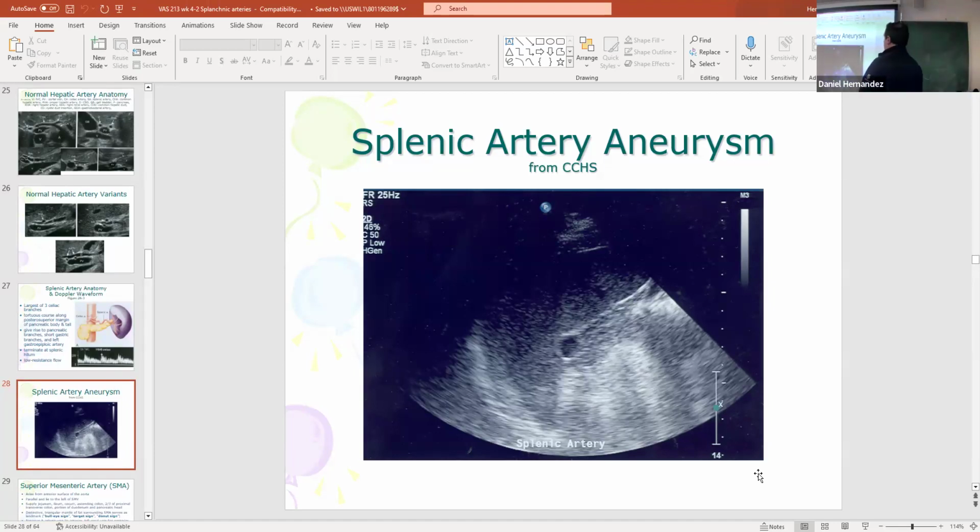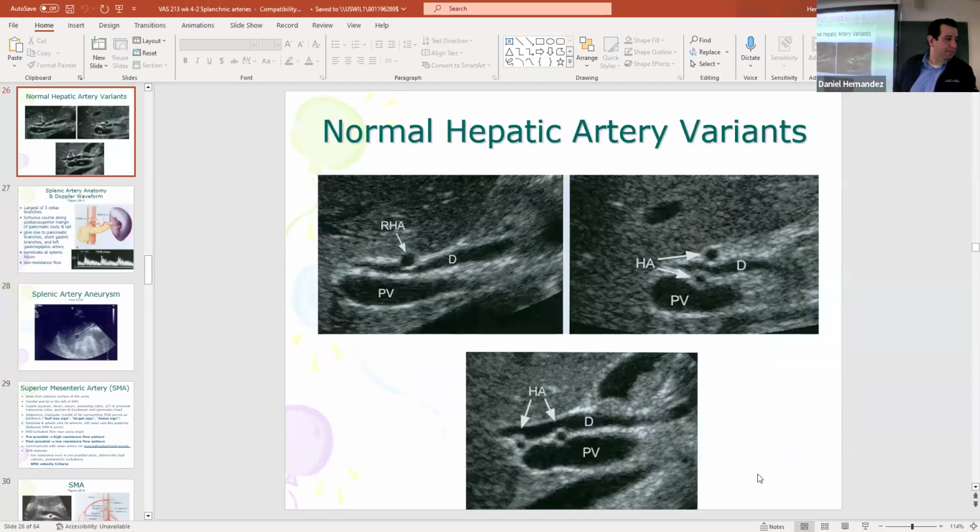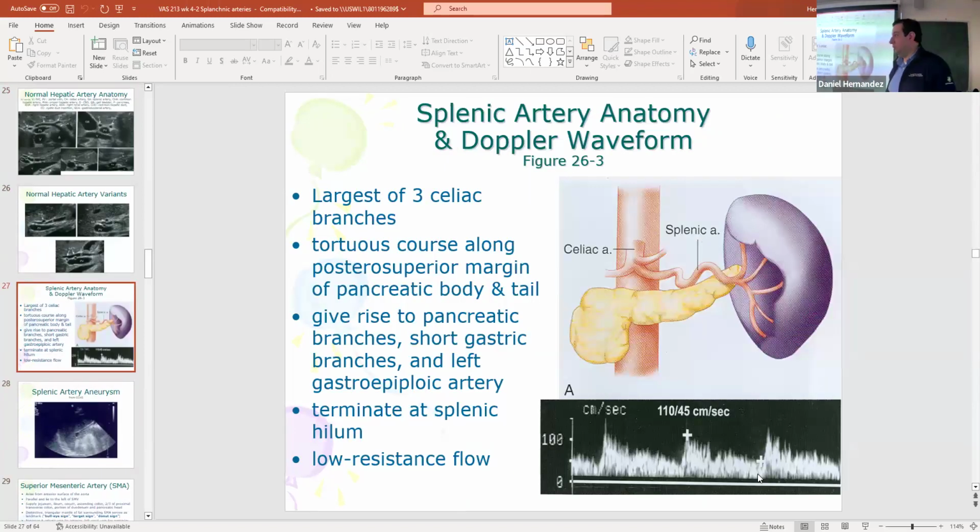So this was trying to demonstrate a splenic artery aneurysm. We're at the hilum of the spleen in our sagittal view. You can see what looks like a large anechoic structure in there that actually represents the aneurysmal splenic artery. You guys actually want to see a tortuous splenic artery scan? His splenic artery, when you're midline like that, you see this thing going like it's bananas. It goes and goes like it turns all around.